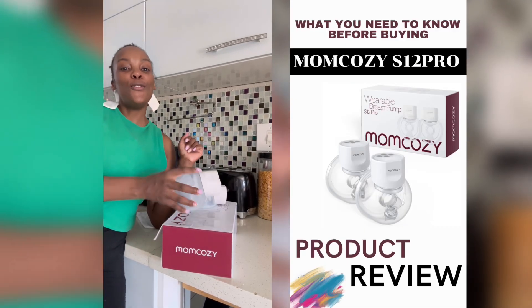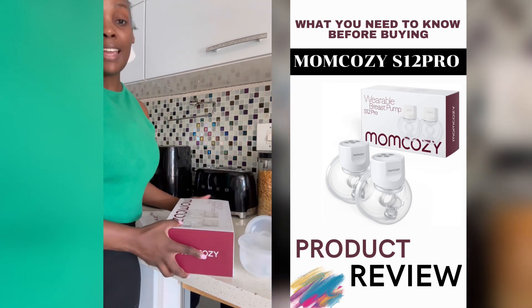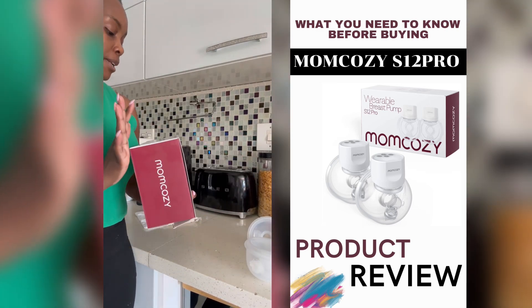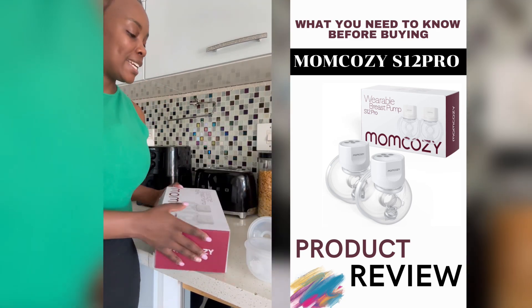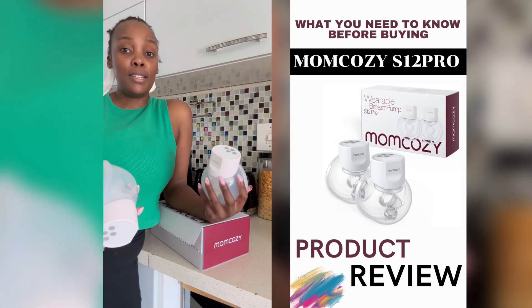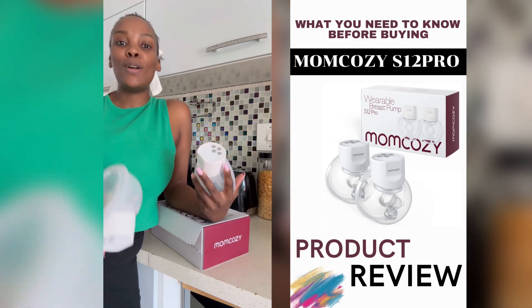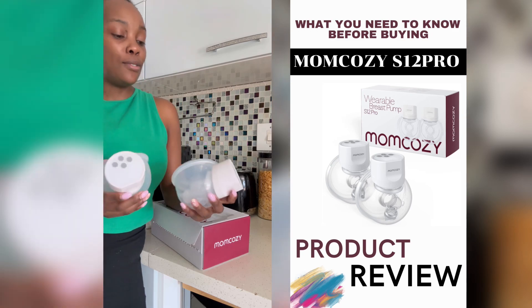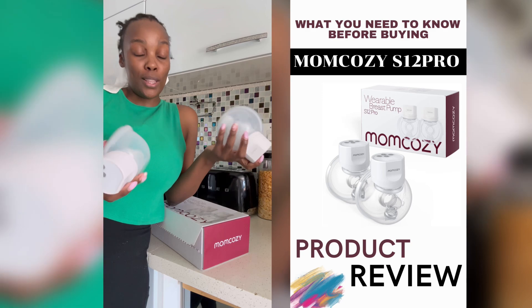Hi guys, so today I'm going to be reviewing the Mom Cozy wearable breast pump — this is the S12 Pro version. I've been using it for the last three months, and my baby's about three months old, so I'm ready to talk about it. One thing about us modern-day moms is that you're busy — you're at work, things in the house — you don't want to be sitting there tied to a pump. I love these, so let me show you the options and what it can do.